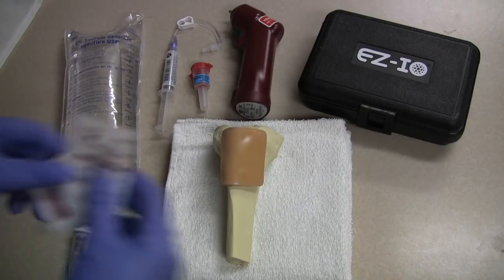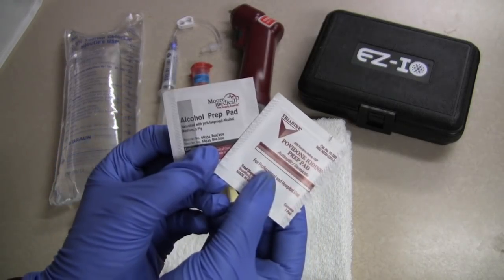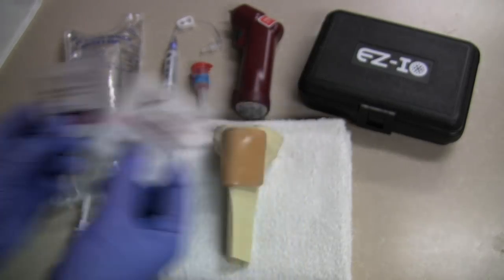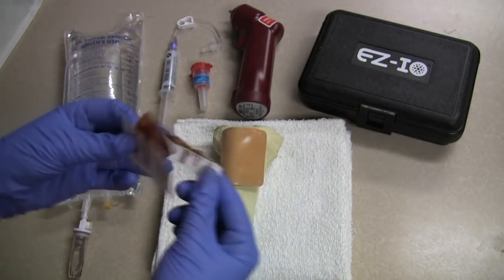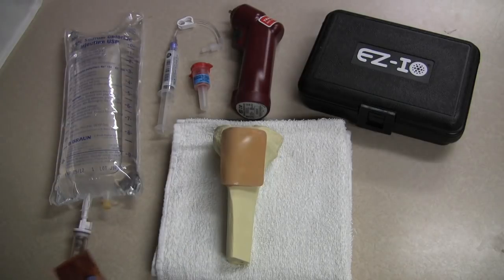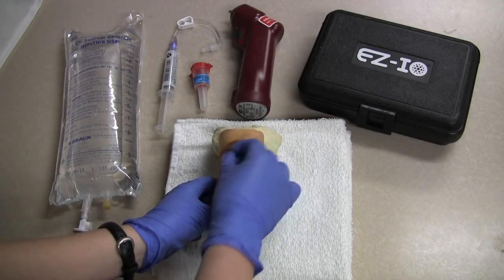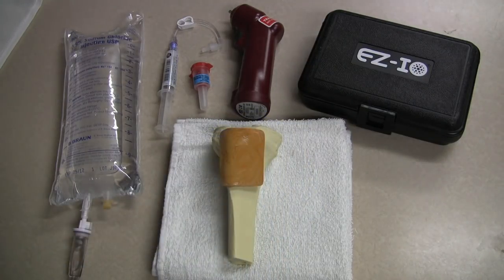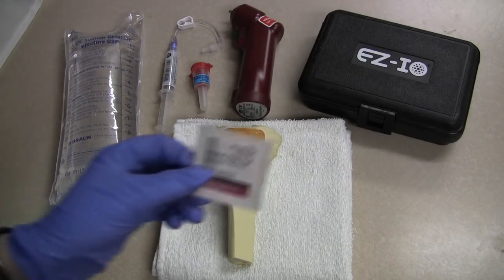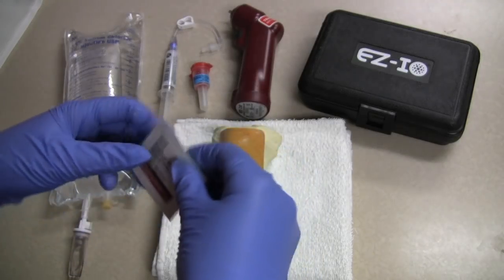So now that we have our location, we want to cleanse the site appropriately. I have iodine and alcohol. Now if there is a potential that your patient is allergic to iodine or shellfish, you probably want to skip using the iodine. Next I will clean with the alcohol.